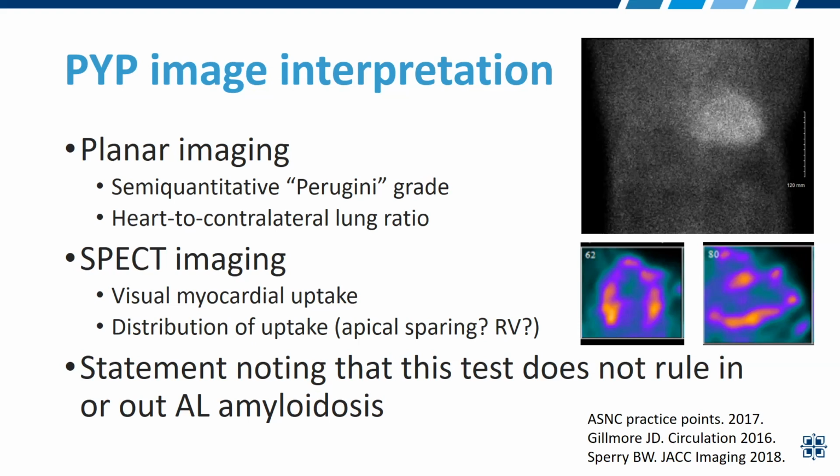What I'll say about that is, after seeing many centers grading and, quote, diagnosing patients with amyloidosis based on planar alone, I really think as a community we need to stop talking about planar imaging and just focus on the SPECT imaging.